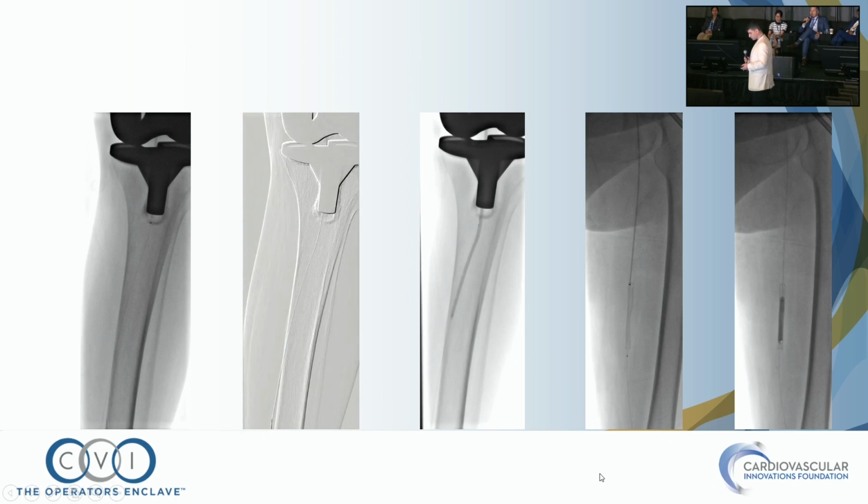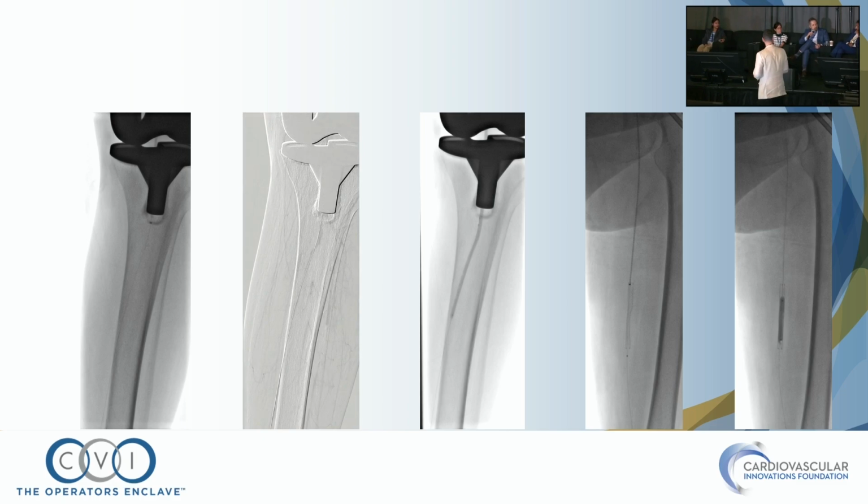So while playing, let me ask the panel. I think it's an important question. So what is good enough? When do you think we're done? Sometimes you keep chasing it. So from the panel, Zach, can you comment about if you have an acute leg, you have clot like this, what's your goal? What are you trying to achieve? When do you say, I'm good, let me stop?